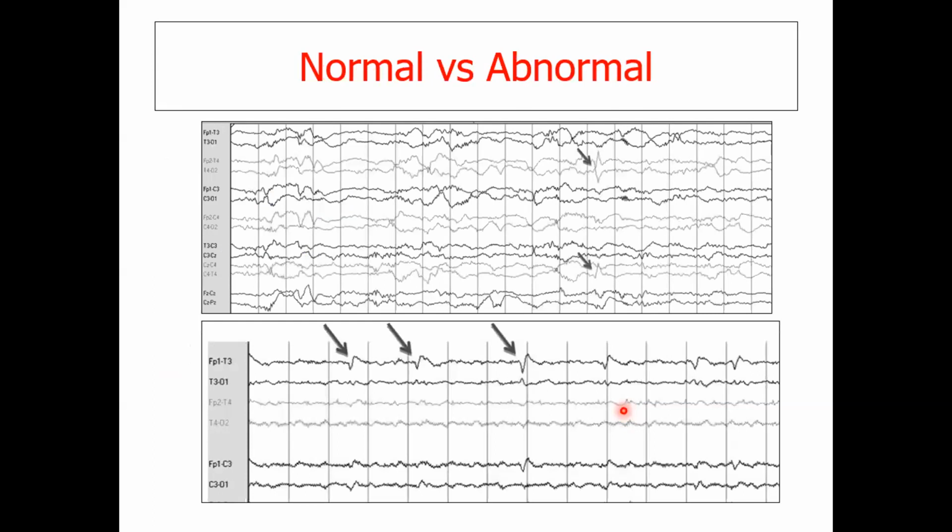Two snapshots of two EEGs have been shown here. Here, if you look at this wave, it looks as if there is a phase reversal. There is an epileptiform discharge here. However, it is just coming once in the entire report. The same thing on the lower snapshot is occurring again and again repetitively. This one is a normal one. This one is likely an abnormal one. It is occurring at the same place repetitively, and there is some amount of phase reversal here.